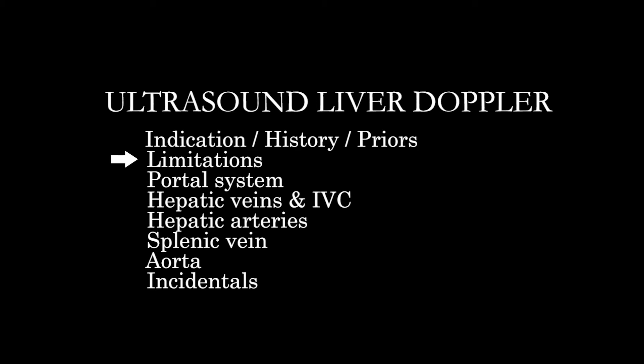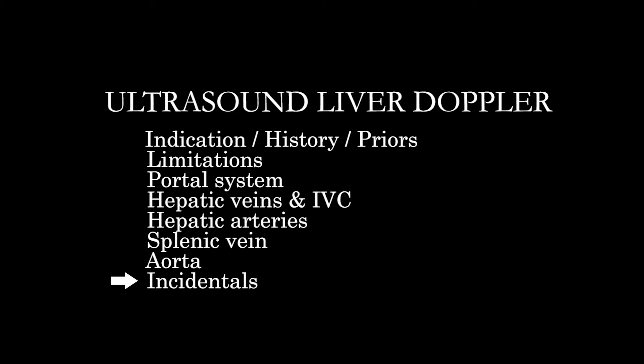We're going to go through and look at the whole study, getting a sense of whether we're evaluating all the anatomy of interest. I like to group them into the portal system, the hepatic veins and IVC, the hepatic arteries, and then the splenic vein and the portal system outside of the region of the liver. You'll also see the aorta, and then any incidentals we may pick up.